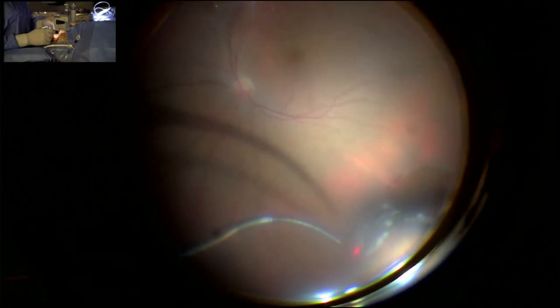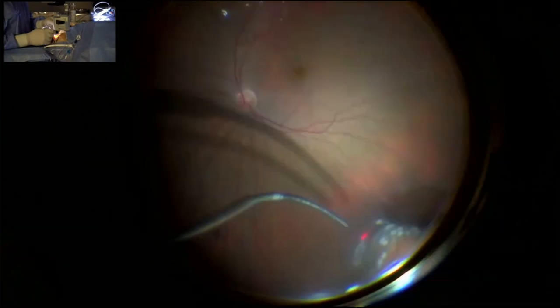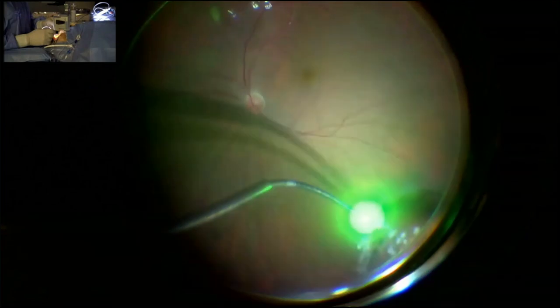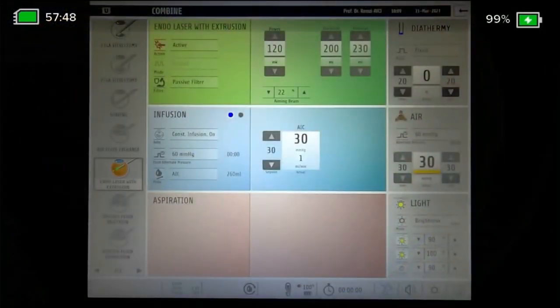You know, this is a curved laser probe. It is a great instrument to do laser to the superior part of the retina. And I like it very much because you can arrange the curve. It is an adjustable instrument with a 23 gauge system. And the power of laser is about 120 now. Not so high. I don't like to do very heavy laser. Maybe we can go up to 130 now.